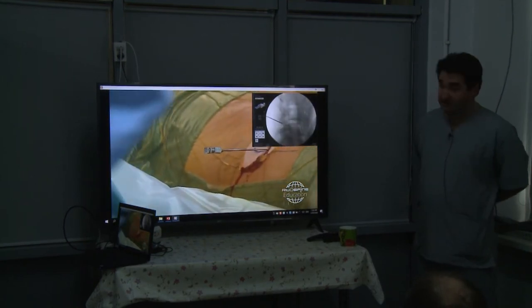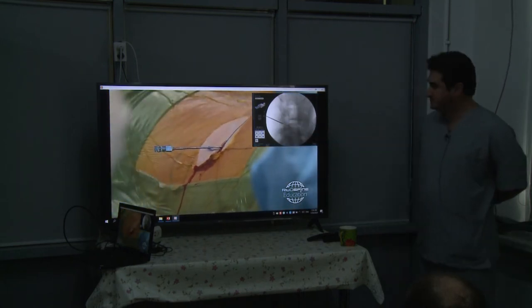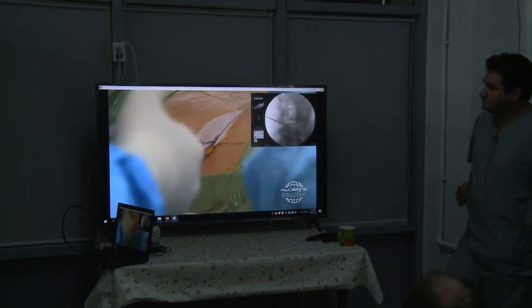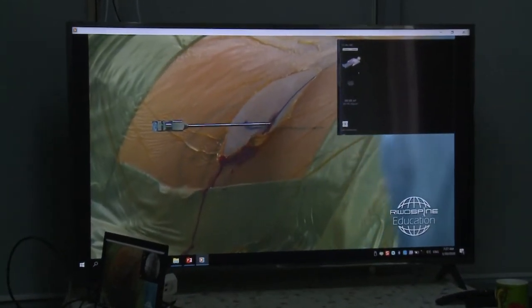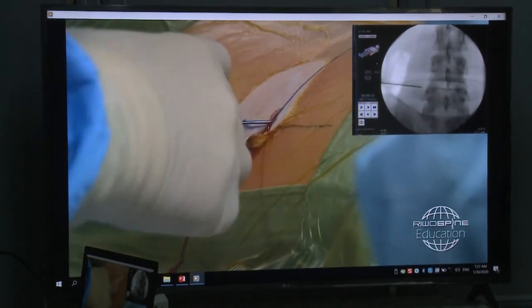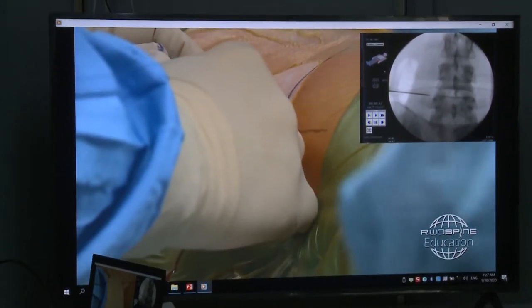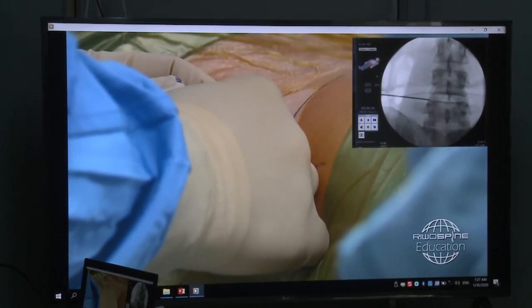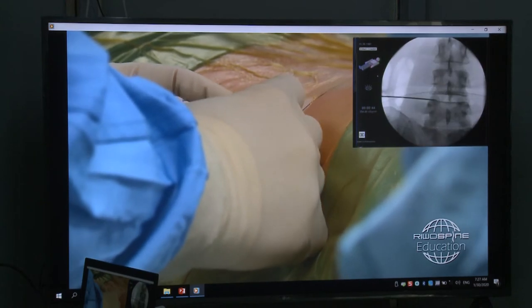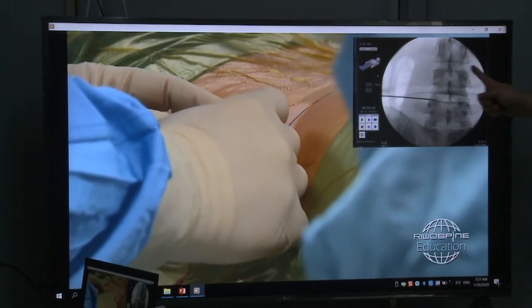Now we see we are dorsal. Yeah, because the root is here and still you are too far. That means I have to correct my needle about 1 centimeter to the ventral aspect to get access to the foramen. So I pull it back a little bit, angle it up. I'm here at the medial pedicle line, in the caudal part of the foramen.